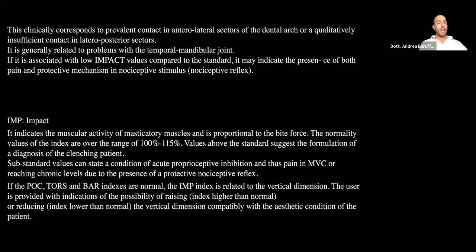And the impact indicates the muscular activity, and important is how we read it, because if the indexes are normal and the impact is related to the vertical dimension, so the user can raise the vertical dimension, or we can reduce it if the index is lower than normal, because usually if we have a high impact, we immediately see that if we interpose something in the teeth, like some raise on the molar, on the premolar, immediately the impact is lowering the value.